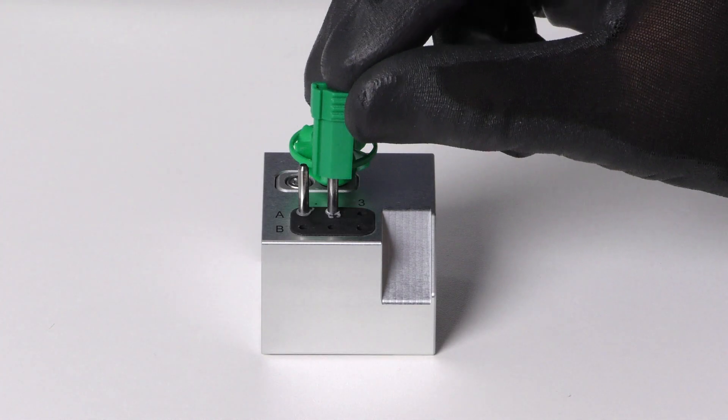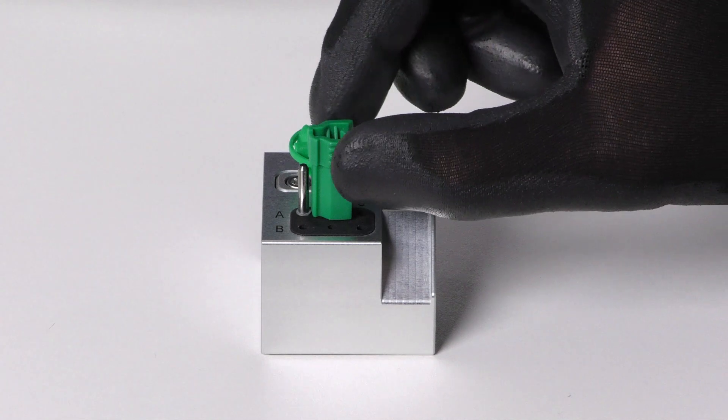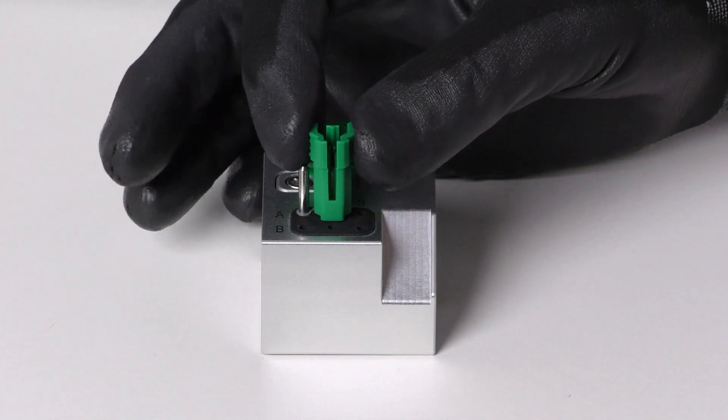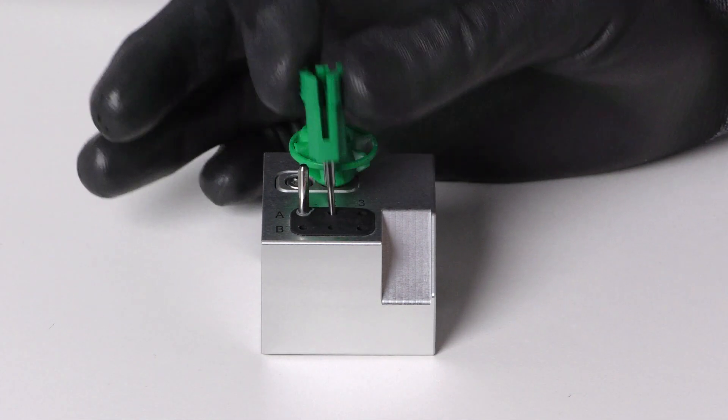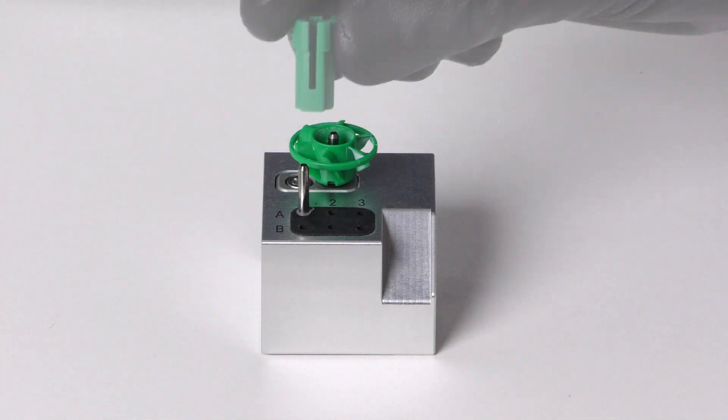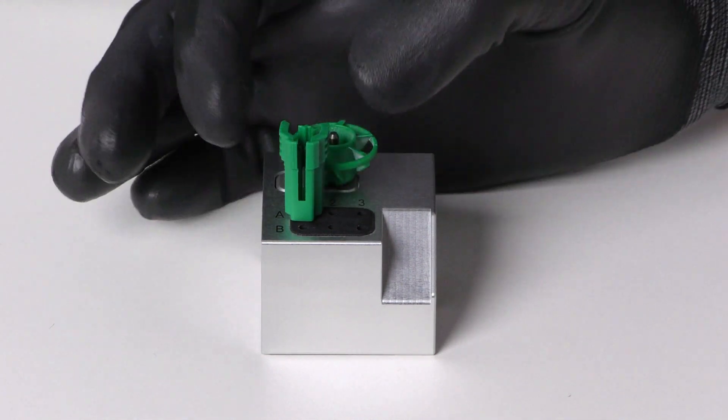To remove a tool, pull it upwards out of the tool magazine. Depending on whether you place the tool back in your inventory or no longer use the tool type, configure Dental CNC accordingly.